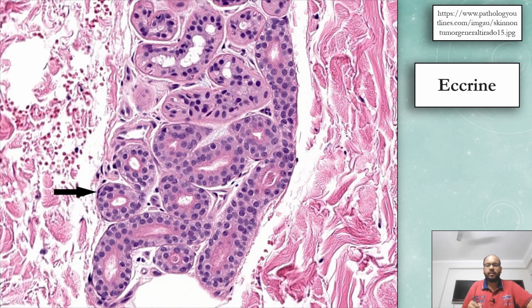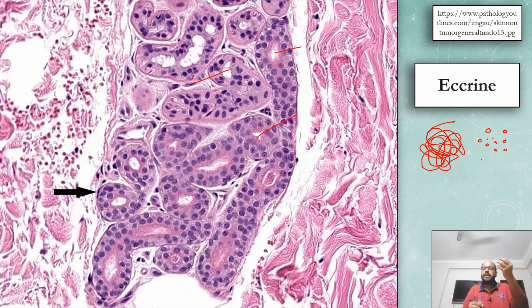So in this histomicrograph, you can easily see the eccrine glands. You can see that they are multicellular lined structures, clumped together. What has happened is the eccrine gland is like this, a coil, and when you cut it in a biopsy section, all you can see are the lumens. And that is what you're seeing here. So this is the eccrine gland, and mostly you see eccrine glands adjacent to a hair follicle, but they open directly onto the skin, as opposed to apocrine glands which secrete their contents inside the hair follicle. Okay, let's move forward.